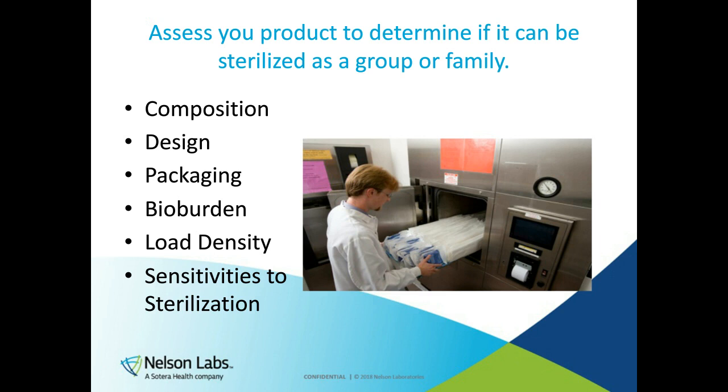Sometimes it is a good idea to perform some feasibility testing to understand the functionality of your product to EO sterilization prior to performing clinical batch release. That way you do have that understanding that your product will be functional. Particularly if it does have a pharmaceutical or some type of drug coating, you want to take that into consideration, as temperature, relative humidity, and the EO gas concentration may have an ill effect on the functionality of the device.